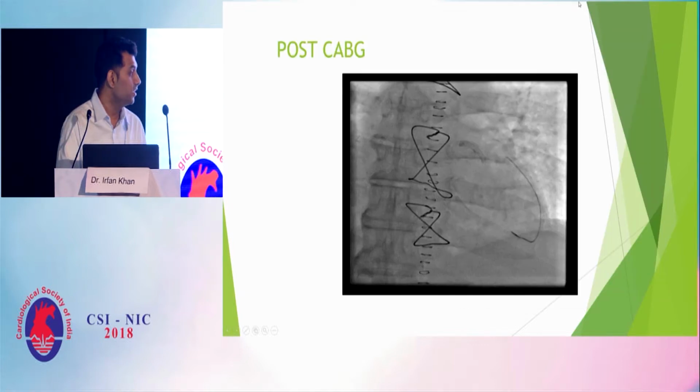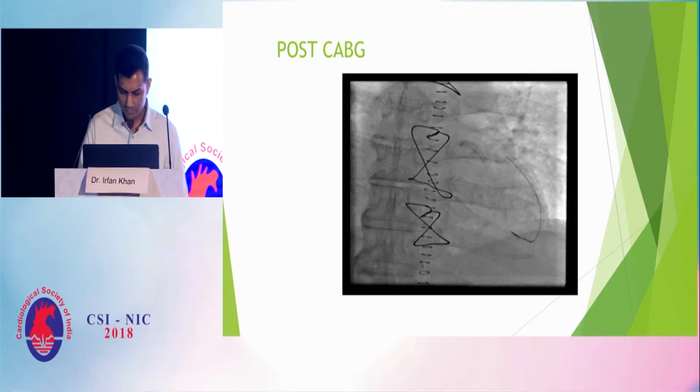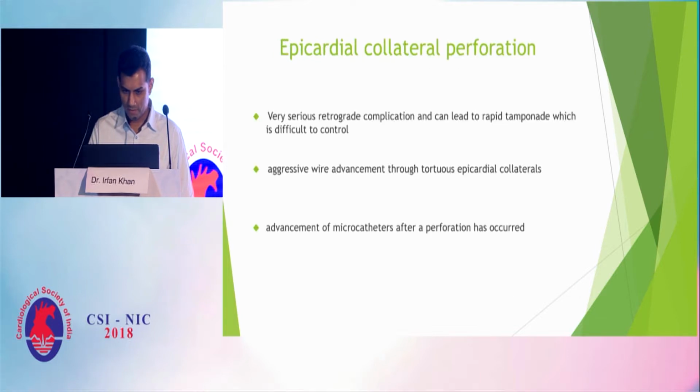In CABG, even the CVTS surgeon could not extract the Corsair microcatheter, and that Corsair microcatheter had to be left alone after putting all the grafts. Very unusual case, but yes, these things can happen.